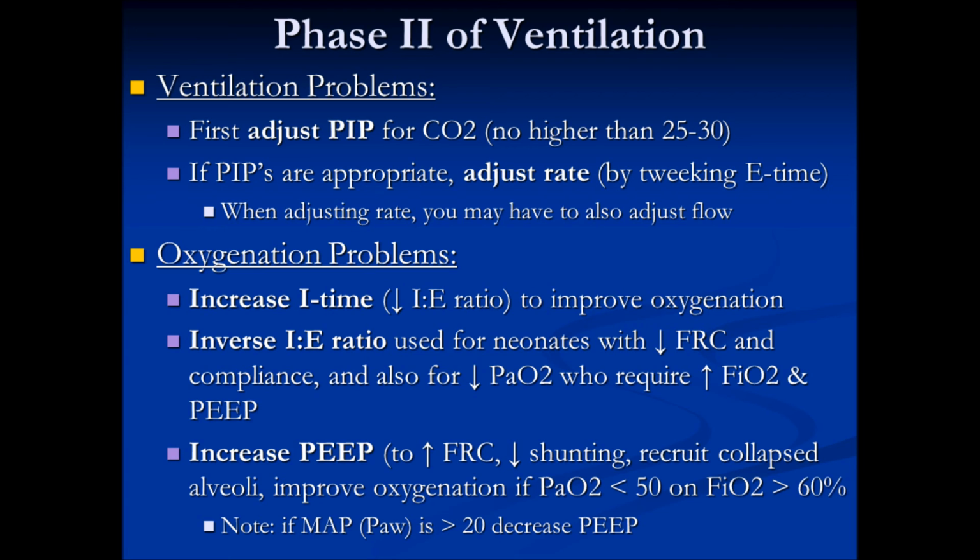You might be talking about inversing your IE ratio, because if you have a longer I time than you do an E time, then as you know, that's inversing your IE ratio. And it might be PEEP that might be the indicator, but if they have high levels of PEEP already, then increasing the PEEP is not your go-to for oxygenation. So it really just depends on what's going on with your baby.